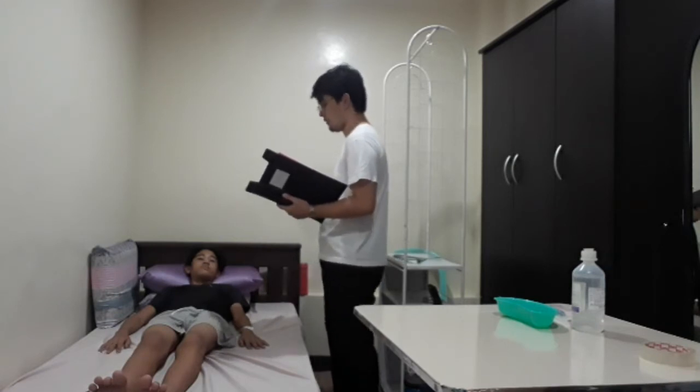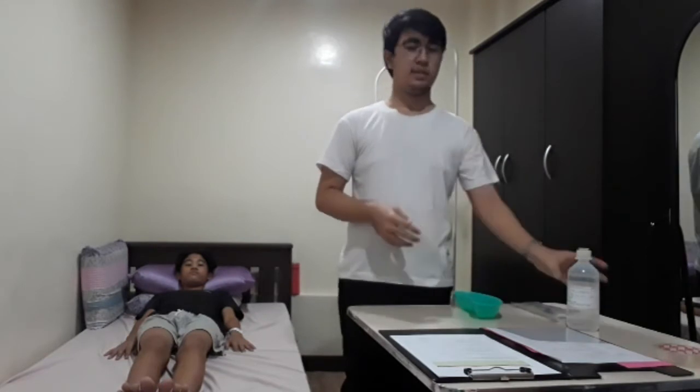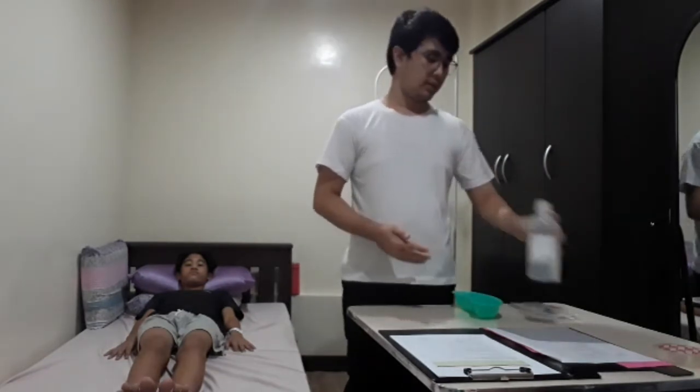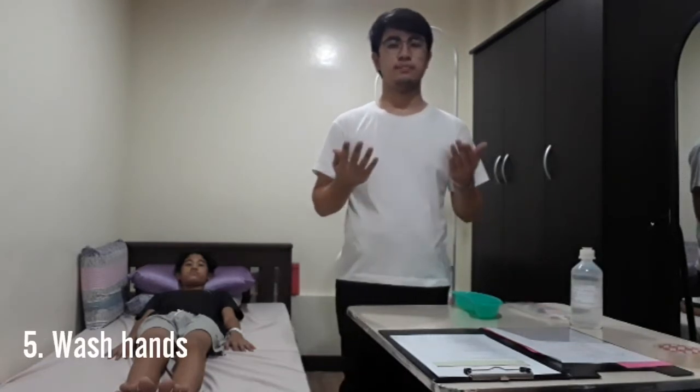Okay. After explaining the procedure to the patient, we will now prepare all the needed equipment such as the kidney basin, the plain normal saline solution, and the administration set. Then after preparing all the needed equipment, we will now wash our hands.